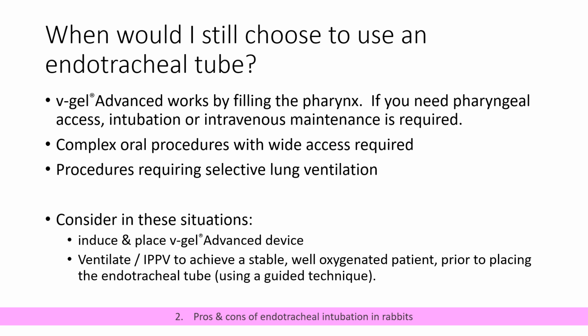My recommendation always with intubation is to use a guided technique, and there are several guided techniques out there. Endoscopic guidance is generally the best, and that's the one that's going to place least strain on the oral structures.